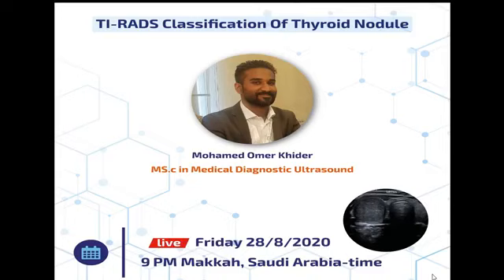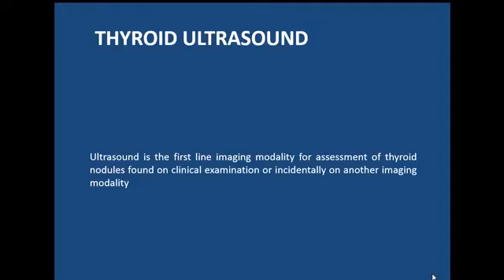Inshallah, our topic today will be about the TI-RADS of the thyroid nodule. And actually the word TI-RADS stands for Thyroid Imaging Reporting and Data System. So today, inshallah, first I will try to explain for you the concept of the TI-RADS and how to apply it. And then we'll go through some cases in order to make us more familiar with the TI-RADS.